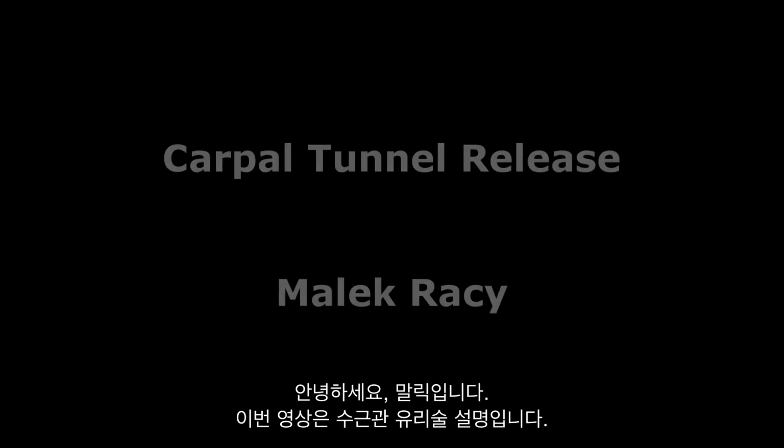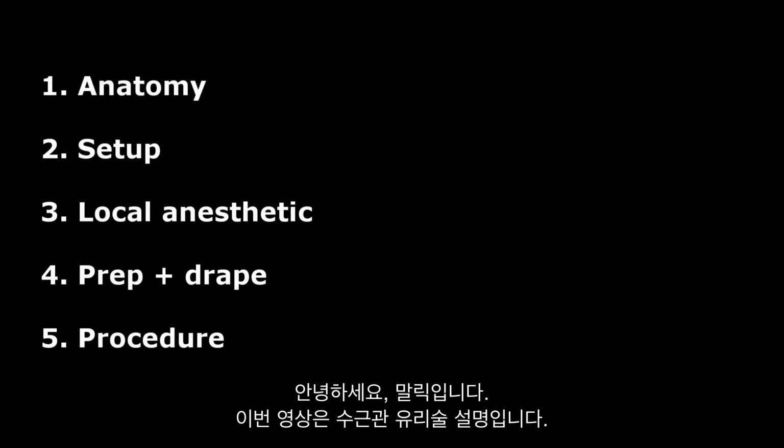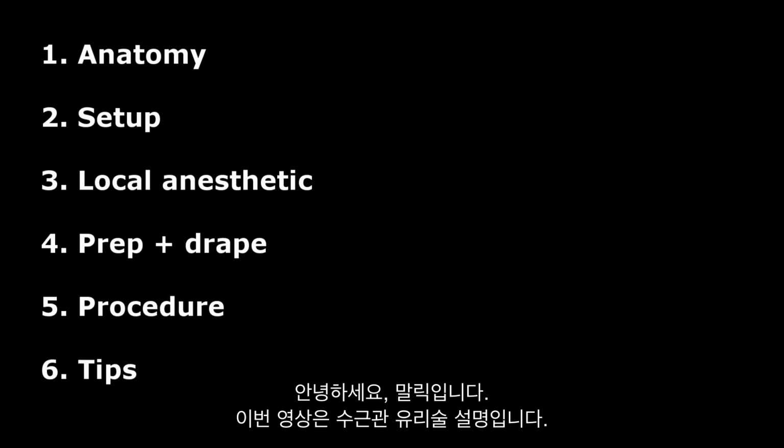In this video we're going to go through a carpal tunnel release. We're going to first of all cover the anatomy, then the setup and preparation, the anaesthetic technique, prepping and draping, and then the procedure itself. We'll end by going through a few tips and tricks to keep us out of trouble.